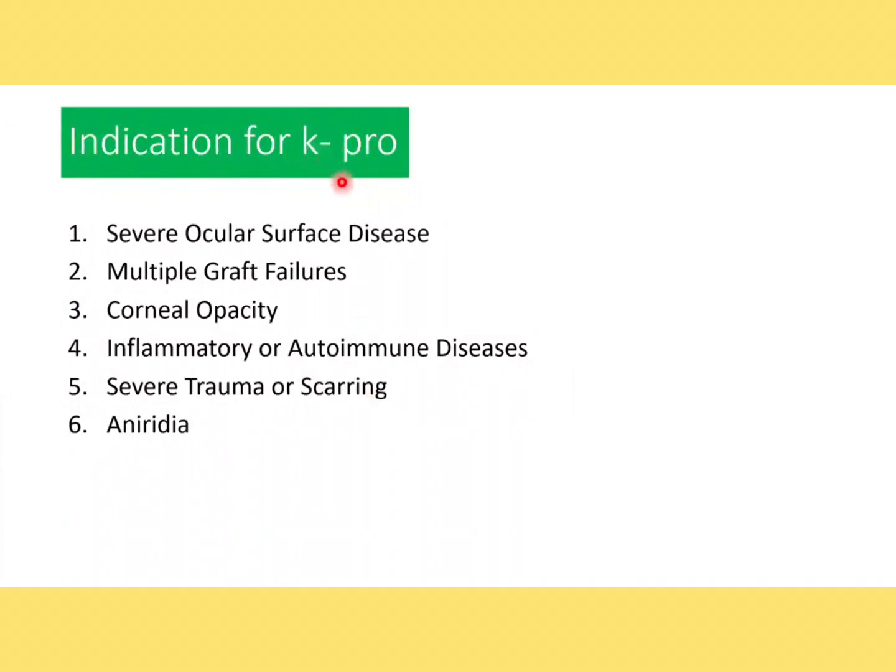So here, keratoprosthesis may be considered for patients with severe dry eye, including Sjogren's syndrome, neurotrophic keratitis, chemical burn, Stevens-Johnson syndrome, ocular cicatricial pemphigoid, and other conditions that result in poor ocular surface integrity. So these patients often have compromised tear film production, epithelial defect and chronic inflammation, making traditional corneal transplantation very challenging in this kind of cases. So keratoprosthesis can be one option for those patients.